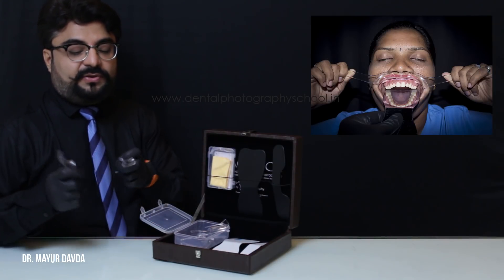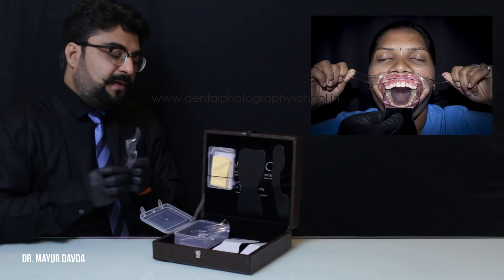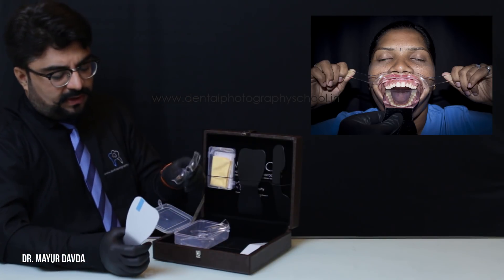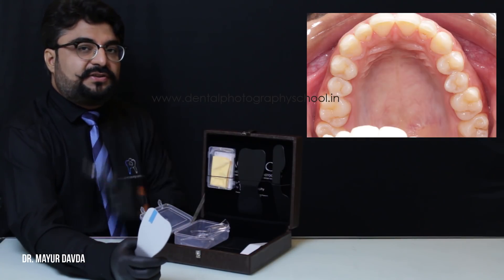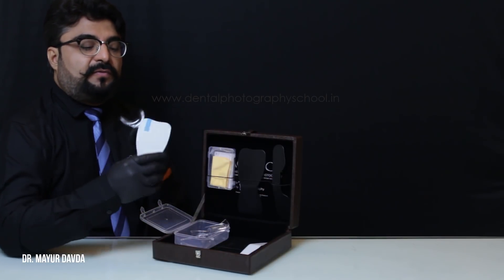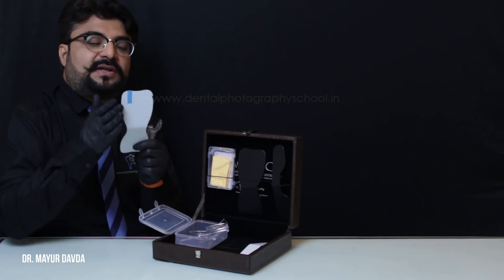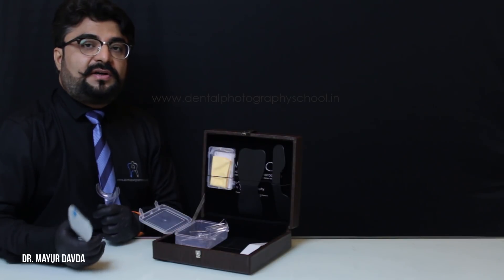Whenever you want to record full arch occlusal images, we use both cheek retractors and retract only the upper lip along with the full arch occlusal mirror. Whenever you use mirrors, make sure you use only the sectional cheek retractors and not the full C-shaped cheek retractors. The bigger side of the mirror has convexities on both sides, which helps you get even more retraction.